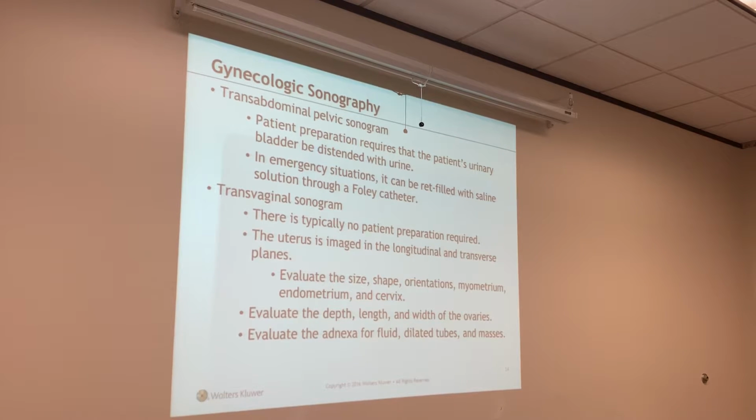When we look at the uterus, we want to evaluate the echo texture. It should be homogeneous. We're going to look at the uterus from the isthmus all the way up to the fundus. Okay, so what we're going to do is tell the radiologist: is the uterus pointing towards the backbone, which would be retroflexion, or is the uterus pointing towards the stomach, which is anteflexion? Is the uterus pointing to the patient's left, or to the patient's right?